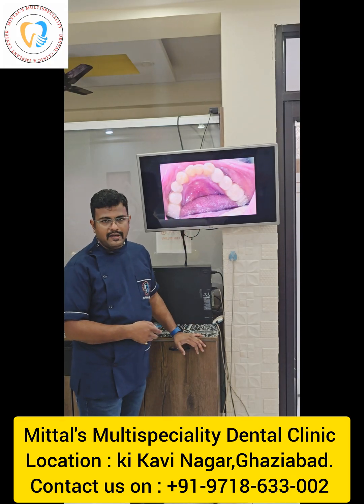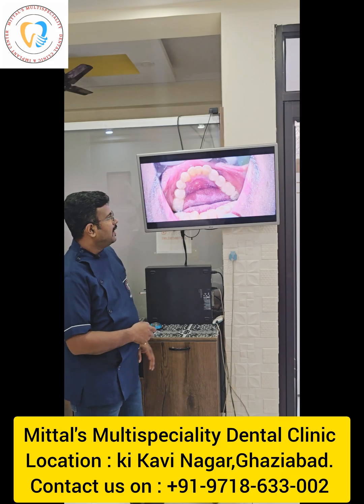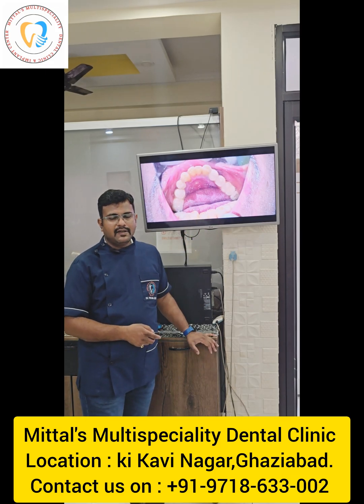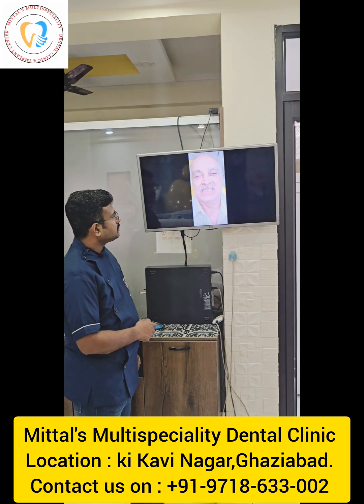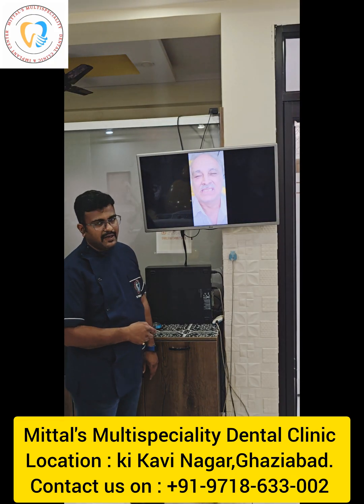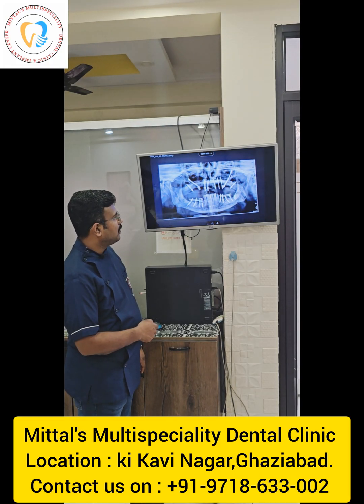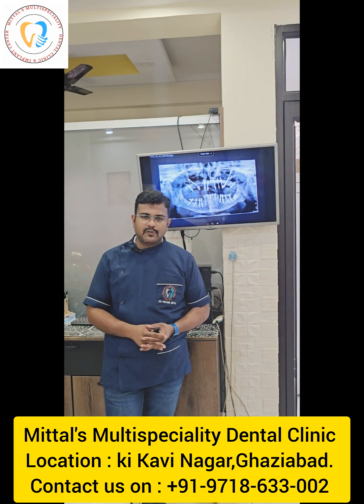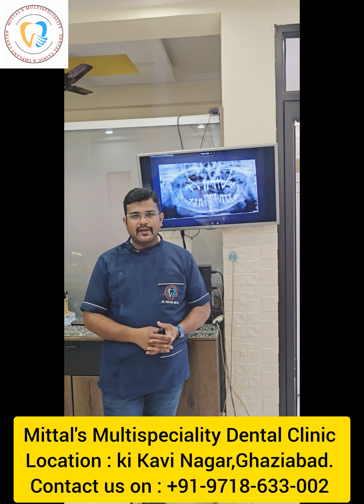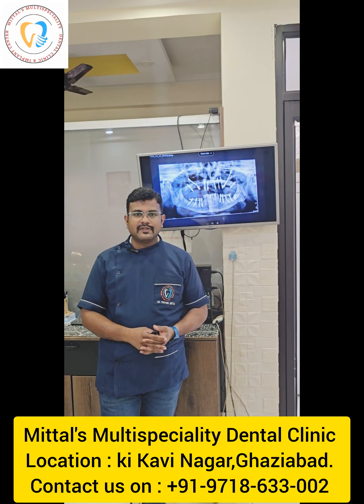The mandibular temporary teeth we have already delivered and luted, and this is all within the time zone of 24 hours. The patient is happy to see the smile. Now this is the final OPG without wiring, and that was with wiring. So now we are waiting for the maxillary arch prosthesis to be delivered as final, and we will carry on this video after some time so that we can show you images of the final prosthesis also.